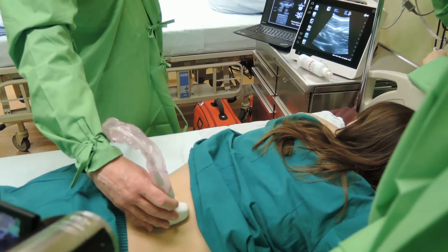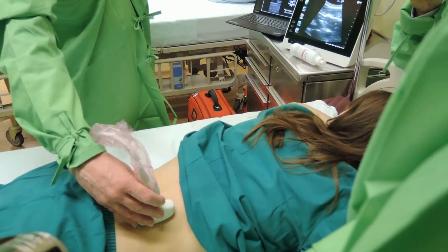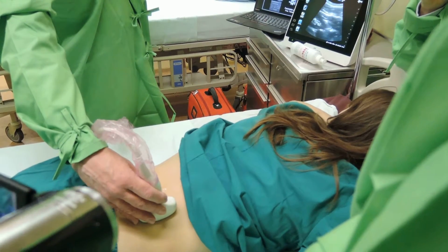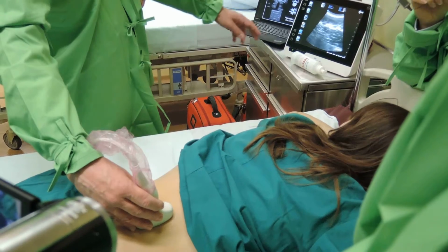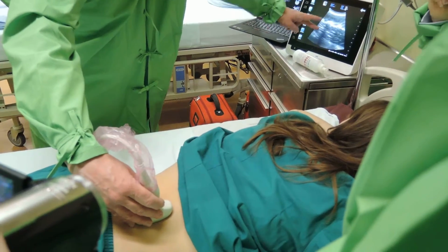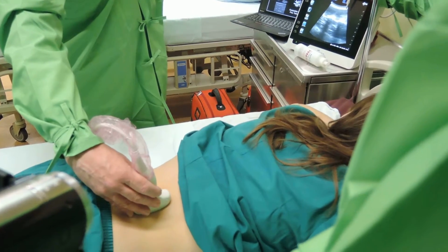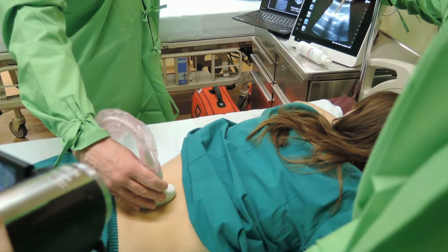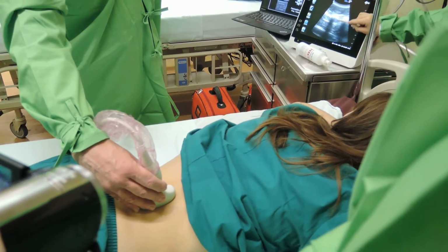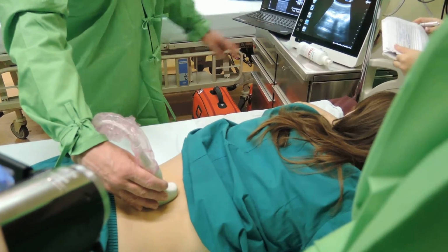We start from the lateral side, in a paramedian position. Now there's the erector spinae, the psoas muscle. So we have the muscle that straightens the trunk, and gradually we move toward the transverse processes as they appear with their shadowing. And what goes down from them are the shadows they produce.